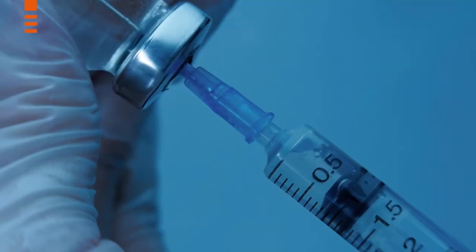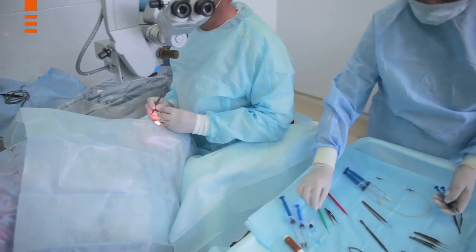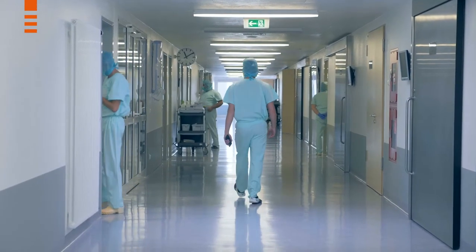Drug Diversion and the Opioid Crisis is a rapidly growing issue, forcing healthcare facilities to evaluate their diversion prevention programs.